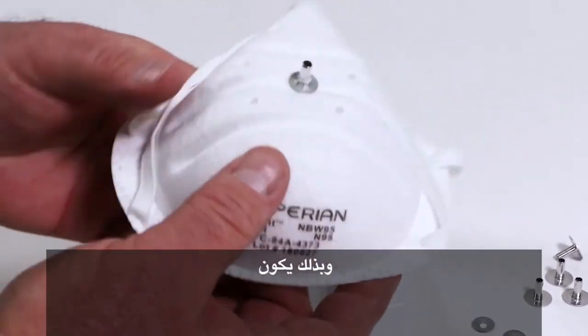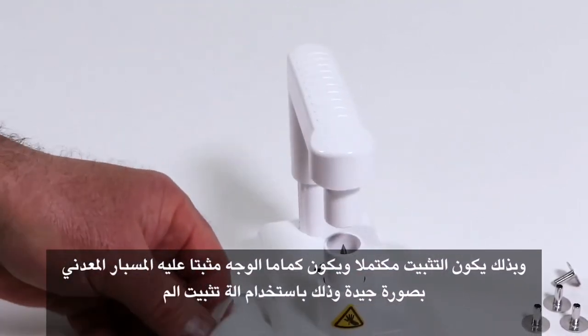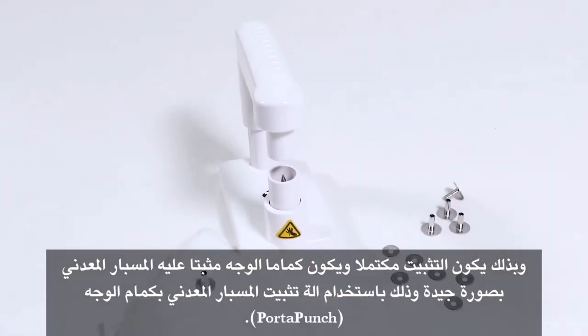That is a good seal. That is a properly probed respirator using the Porta Punch probe insertion tool.